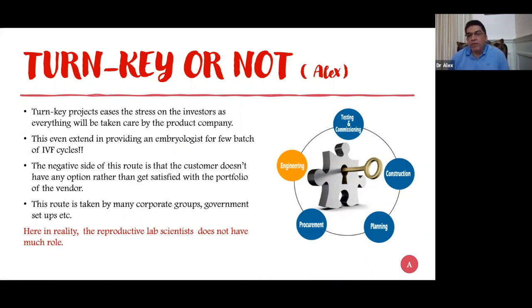The customer won't have much choice. That is one of the issues, but it is one of the easiest things, that everything will be taken care of by a particular company, starting from the designing to the construction to procuring the equipment. Sometimes they even provide a freelance or consultant embryologist.